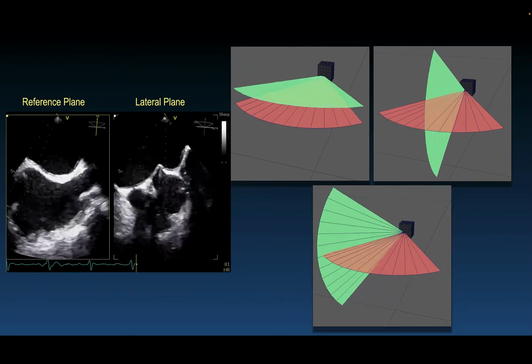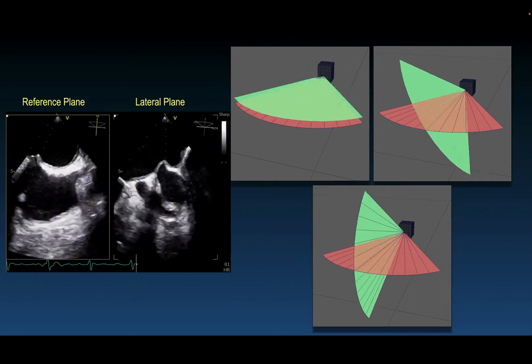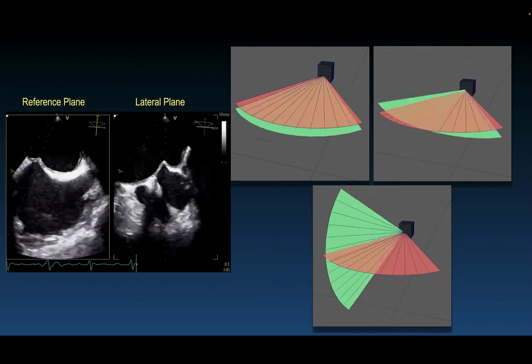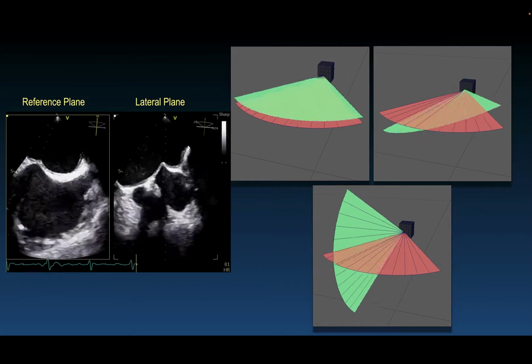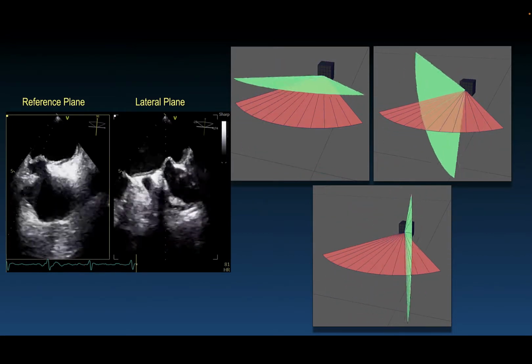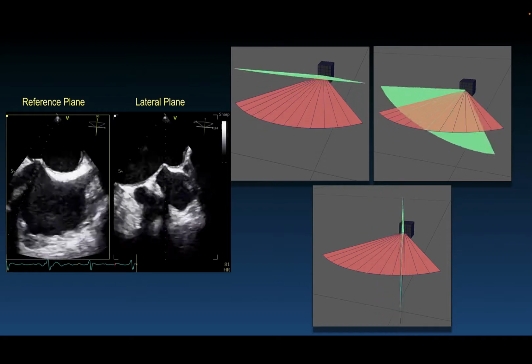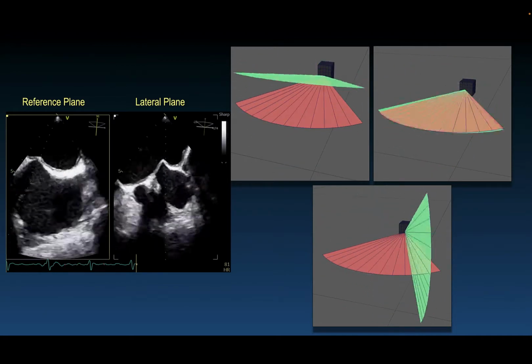For example, simultaneous orthogonal plane of this bicaval window would end up showing the aortic valve on the left side of the screen in the lateral image, which can sometimes be a little disorienting for people doing this. Since everything is dependent upon the echocardiographic orientation, unless you can rapidly correct it to put everything into the correct anatomical orientation and know exactly where the indentation is, I'm not terribly inclined to use it.